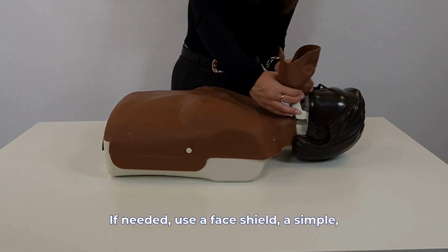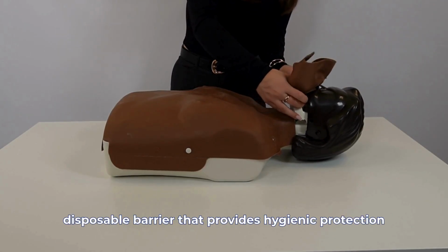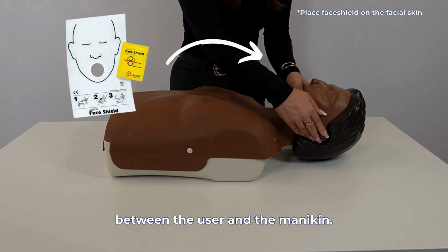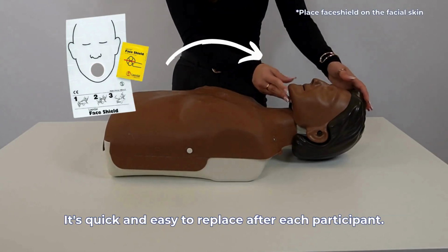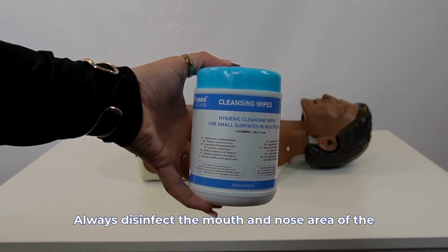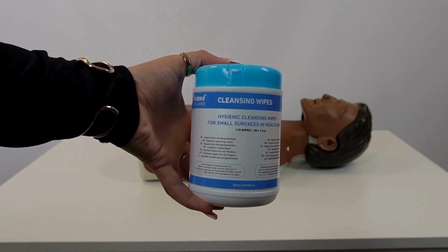If needed, use a face shield, a simple, disposable barrier that provides hygienic protection between the user and the mannequin. It's quick and easy to replace after each participant. Always disinfect the mouth and nose area of the mannequin after use.